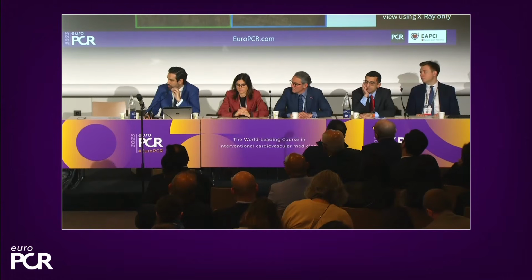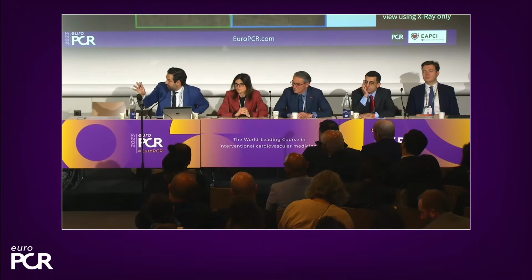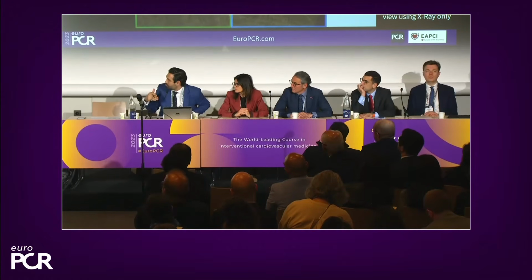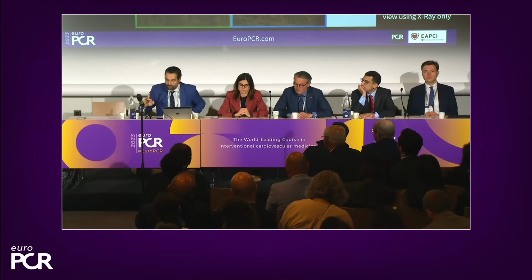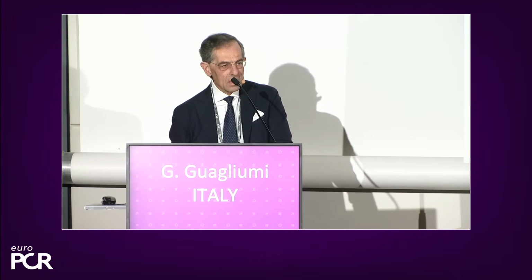Giulio, I have to say that when I saw this technology, I was very excited. But the potential that this has to really inform us about stent expansion is huge. I envision that in the future, we will implant the stent, we will do the rotational angiography, and automatically we will get MSA in front of our eyes, automatic, in real time. And this is going to be something that will really facilitate our work in terms of always achieving an adequate stent expansion. Okay, long way to go, collecting data, proving the essence.